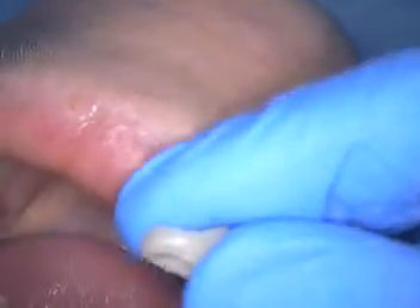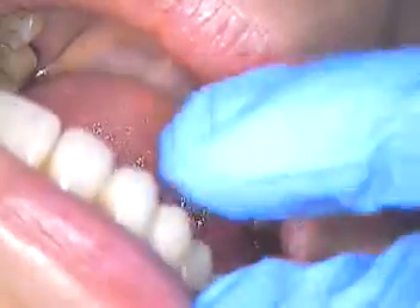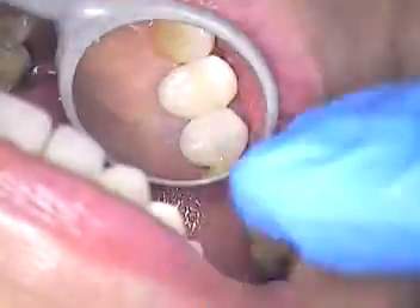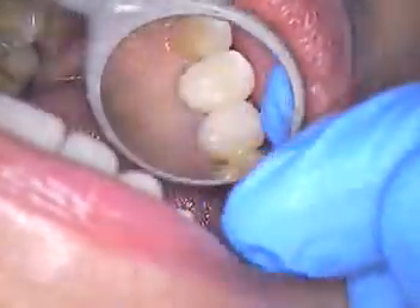So now we're ready to put our temporary in there. We're going to take a few photographs with our microscope. Let me fit our temp first. This is what it looks like now, all polished up. Cotton roll ready. And there's our temp — it's a little lighter than the tooth, but it looks okay.